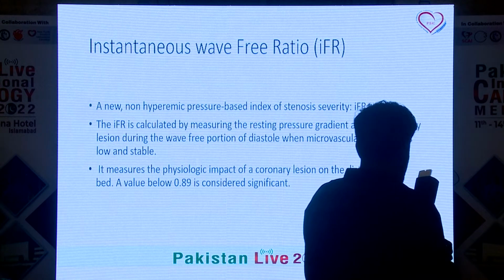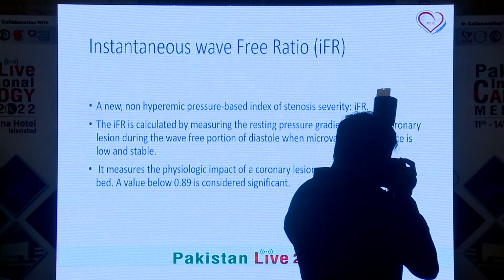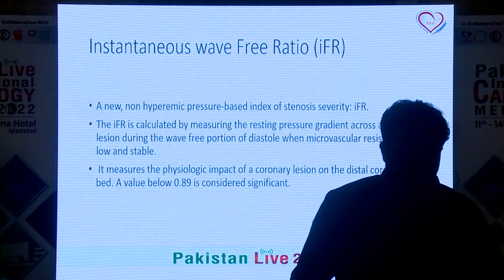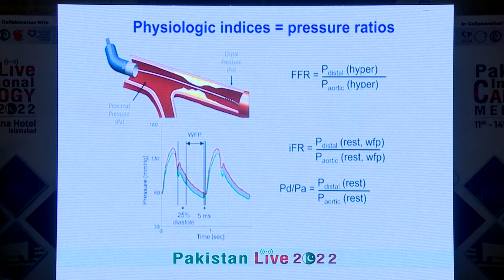What is instantaneous wave-free ratio? It is a new non-hyperemic pressure-based index of stenosis severity, which is iFR. It is calculated by measuring the resting pressure gradient across a coronary lesion during the wave-free portion of diastole, when microvascular resistance is low and stable. It measures the physiologic impact of a coronary lesion in the distal coronary bed, and a value of 0.89 is considered significant in this case. No hyperemia needed for iFR. And these are the non-hyperemic variables. This is iFR and Pd/Pa, not very well clinically validated. That is your mean pressure throughout the cardiac cycle, and for that a value of 0.91 has been suggested, but not clinically well validated. The guidelines have supported FFR and iFR use as a class 1 indication.